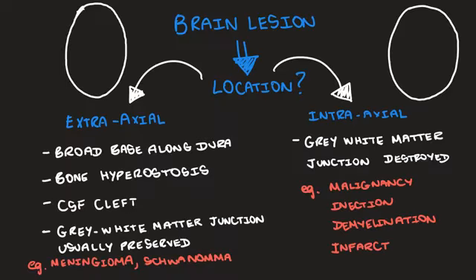So hopefully this video has just given you some basic ideas as to how to tell the difference between an extra-axial and an intra-axial brain lesion.